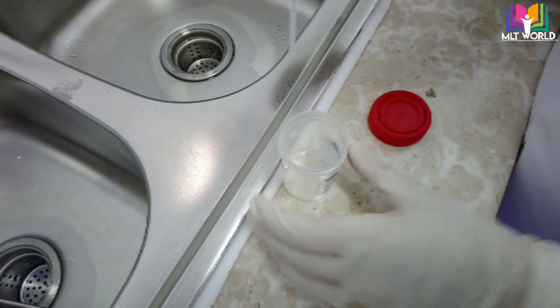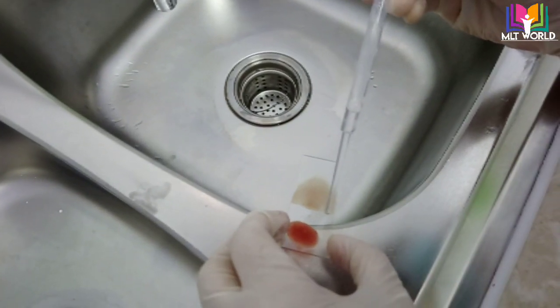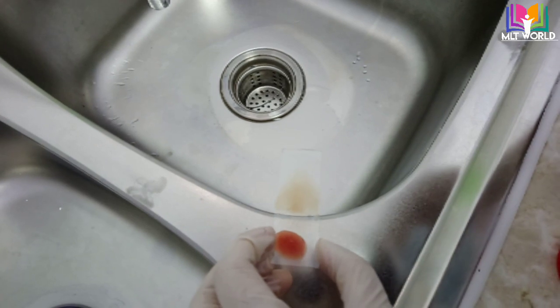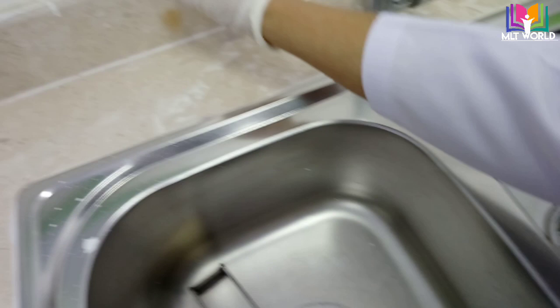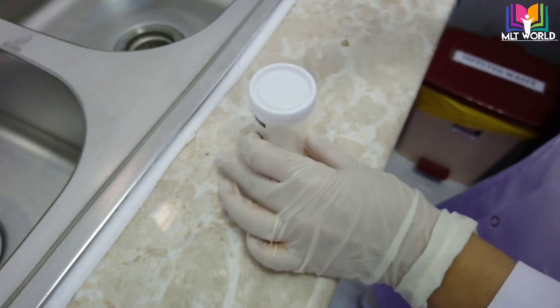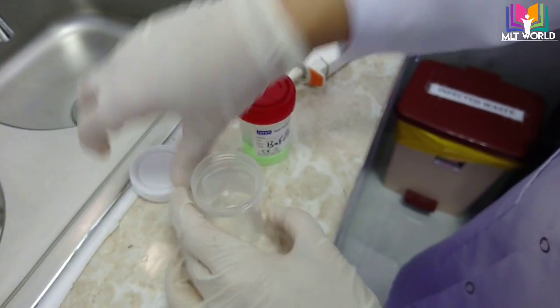You can see the methanol we transferred into a small container. Now with the help of a dropper we will fix the thin smear only. Be very careful — the thick smear should not be fixed, only the thin smear. Then keep it aside and let it dry properly.